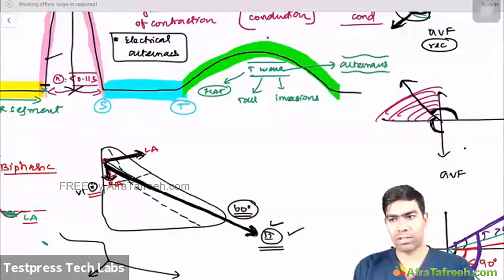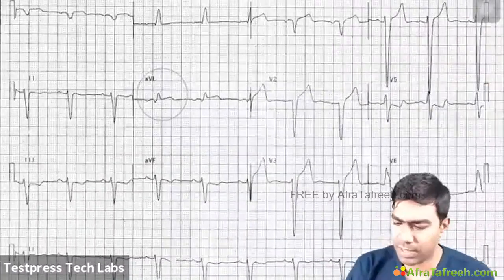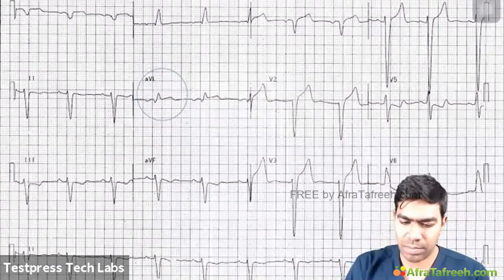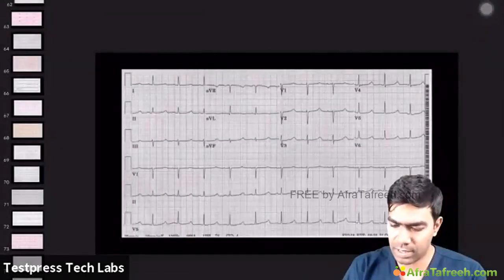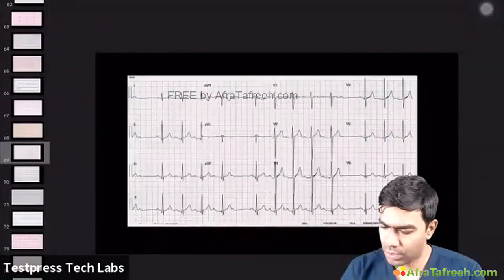If it's coming at the same time, from the same area, then that can be considered as that particular wave unless proved otherwise. For example, because this is a very basic question, somebody is asking, how do you find out if it's a T wave or a P wave? For example, suppose I want to take an ECG, let me take an ECG here. What ECG to get confused?